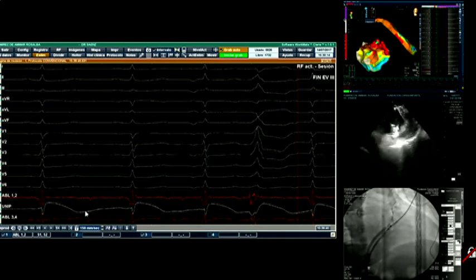The neck works. I think it's a matter of practice, and everybody does the best they think. We have had bad experience in the neck with anticoagulation, and our team in general has moved away from the neck, except for very special rare conditions, because the axis from below works well. But I respect your opinion, and I think that it is very valid. And either of the 2 approaches, I think, is functional.